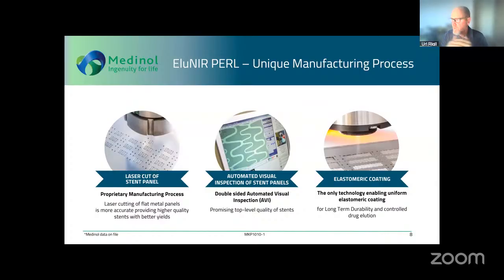This significantly increases our manufacturing quality, because we're checking every stent, not by humans, but by computers, to make sure that all the struts are properly cut. If there are any issues with the cutting of the struts, they are discarded even before we continue. Eventually, it influences the way that we coat our flat panels, because we have a much more uniform way to coat our stents, both with our polymer and with the ridaforolimus drug it holds.